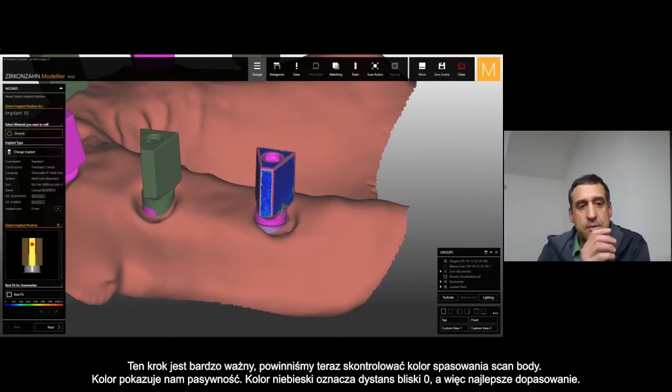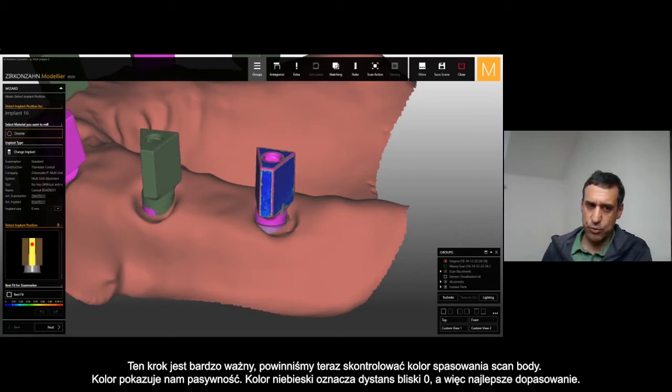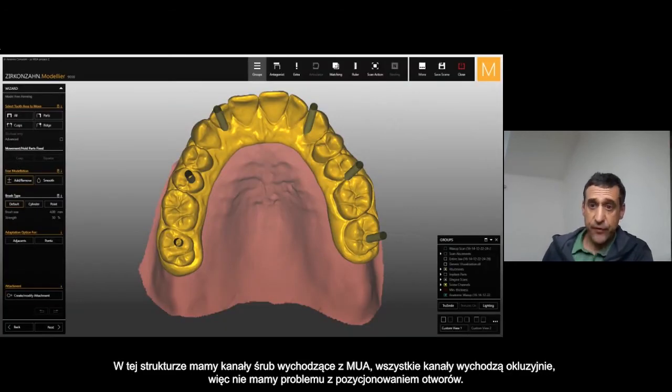That's really important — this step: control every time the color, the matching color between the digital and the scan body. That's important to be sure about the fitting. The blue color is close to zero, so the matching is really accurate. You can see right now the framework and the channel screw coming out from the multi-unit — all channel screws are coming out occlusally.